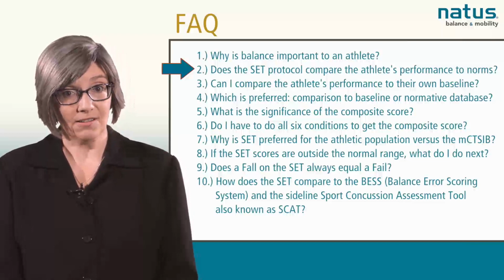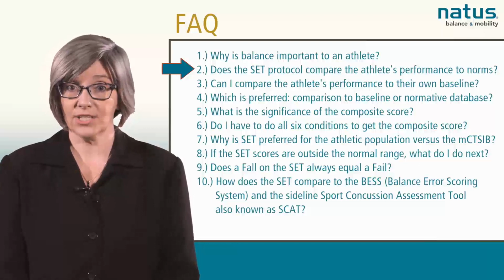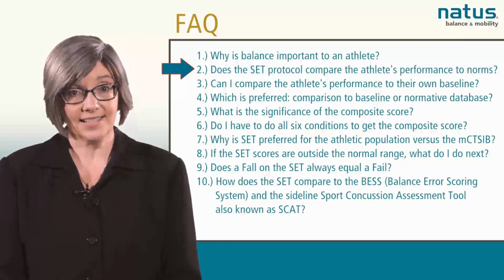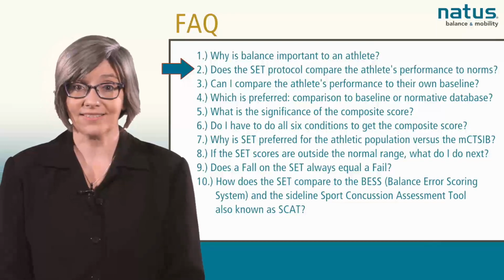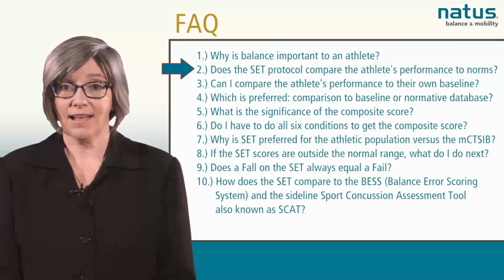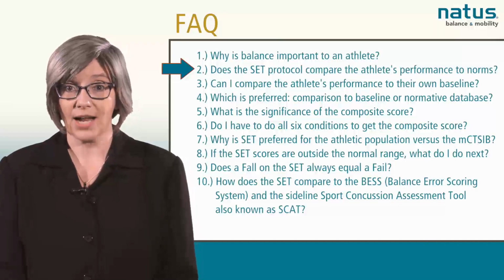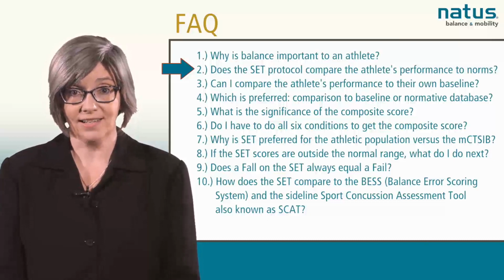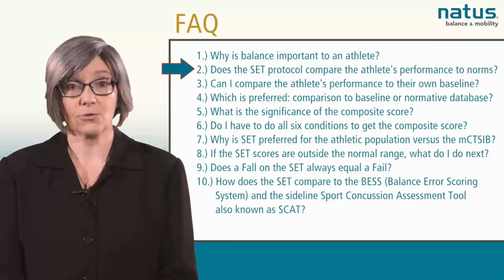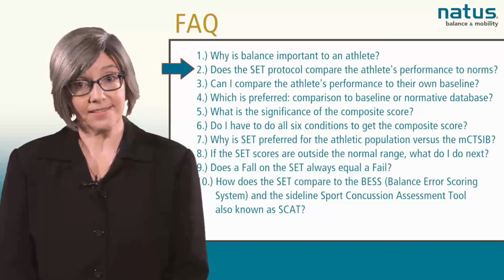Yes, the SET protocol is based on data gathered from 4 sites using an athletic population from 13 to 25 years of age. The mean age is 19 years and standard deviation of 2.3 years. That population was predefined as having normal balance control, as the subjects were actively participating in sports, not currently being treated for any neurological or orthopedic injury, had no recent history of concussion in the past 12 months, and were not currently under treatment for any of the same. A total of 380 subjects were tested.